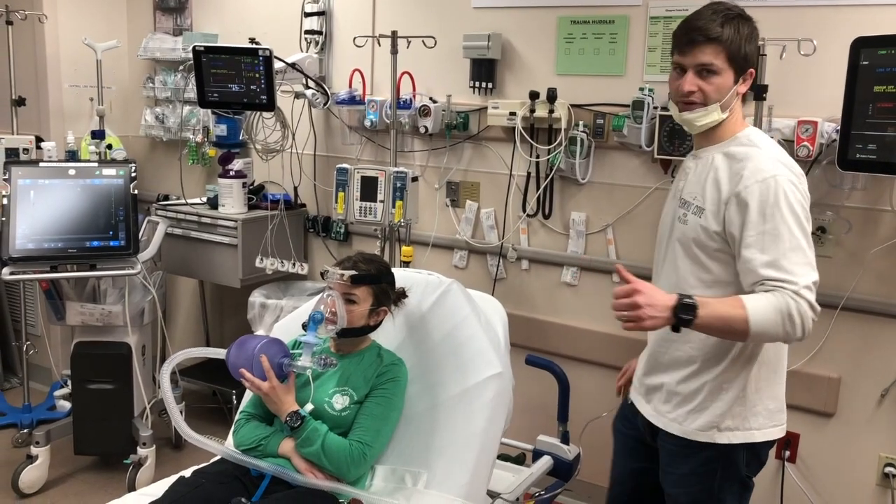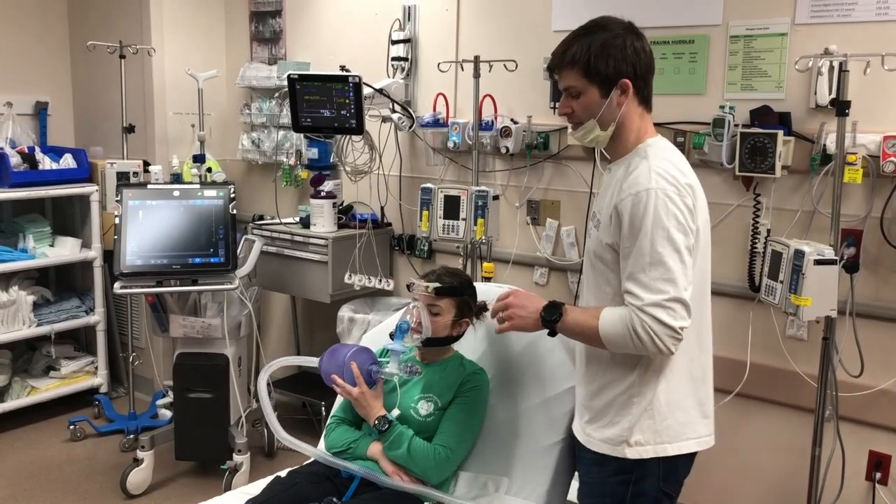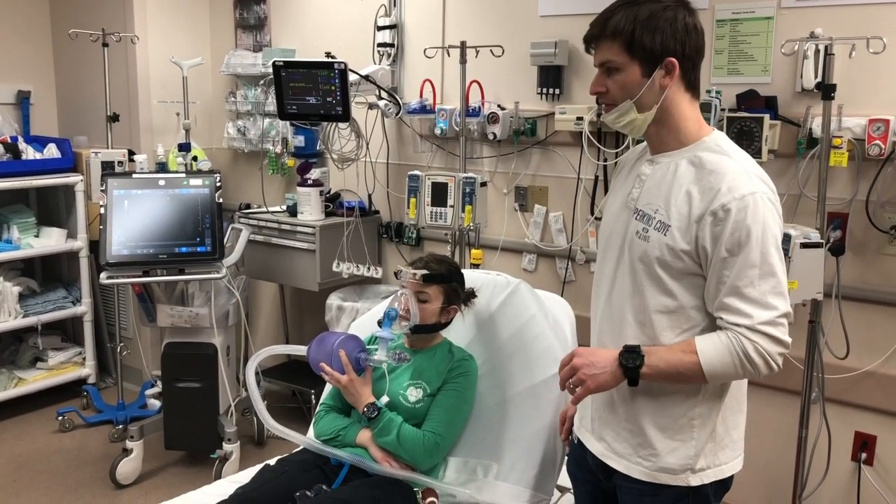To give credit where credit is due, this is Scott Weingart's idea from the EMCrit podcast — just our adapted version, because we have a couple of differences in our equipment.